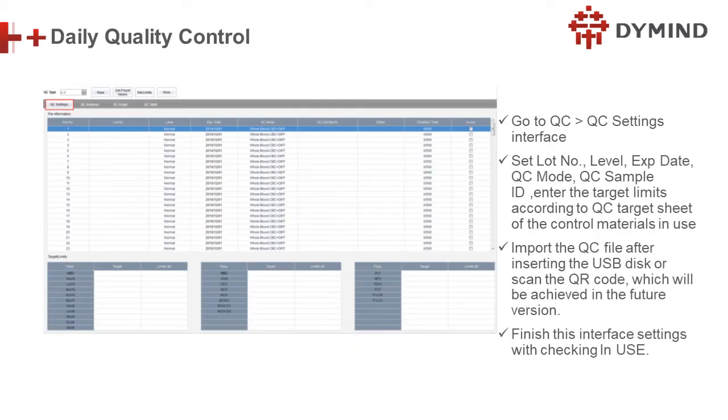This is the daily control, daily quality control. So every day, the first thing in the morning, we have to do the control check. Some hospitals do one level, they use the normal level control, and they only do it once. Or some laboratories use three levels, low level, normal level, and high level, and they check the control. For what? To confirm that the machine is in good status, and the machine and the reagent are in good condition.